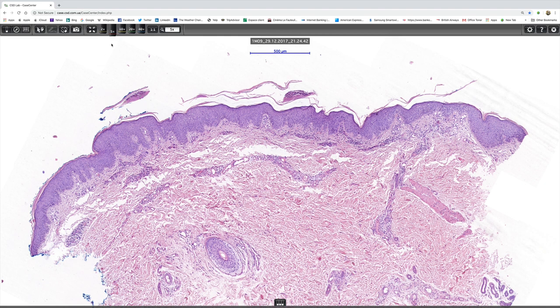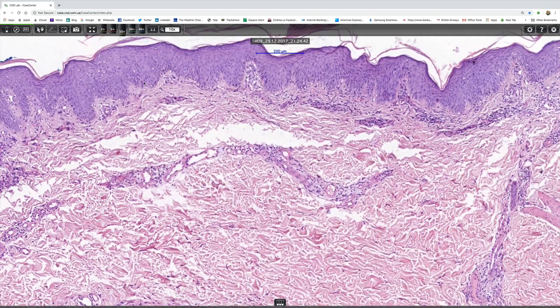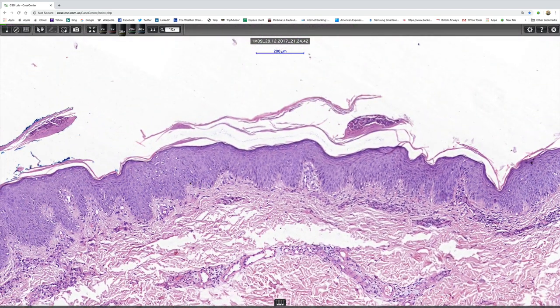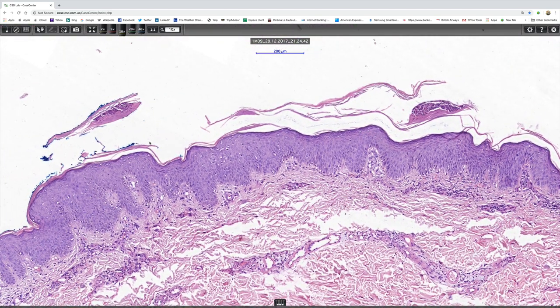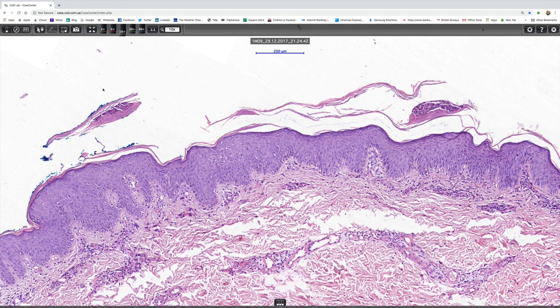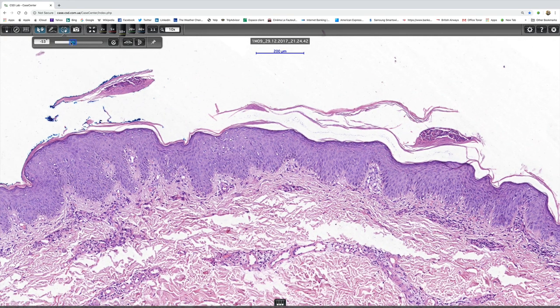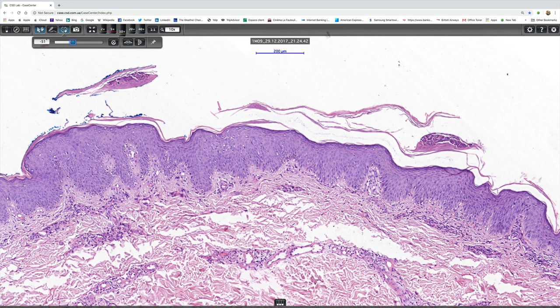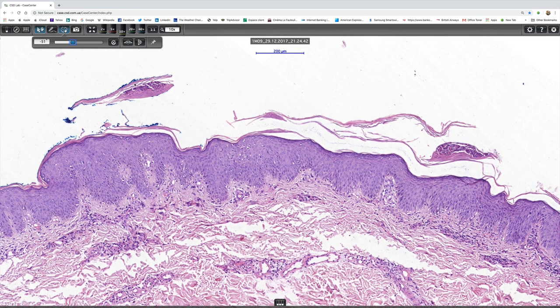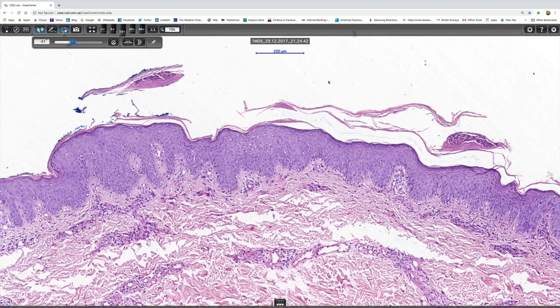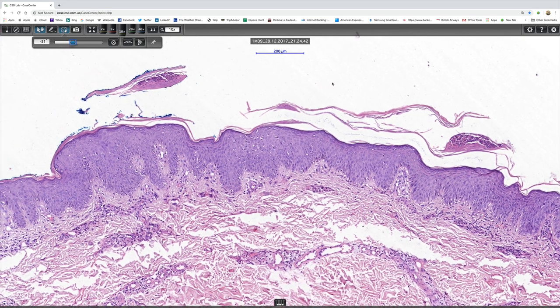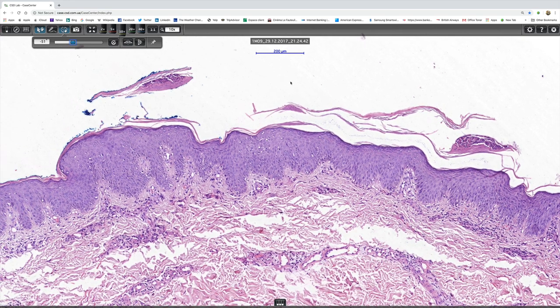Now, let's look at this at higher power and see what. Well, isn't that just so nice? You can see why I couldn't resist showing this to you. It's just a lovely example. There's orthokeratosis. Underneath is parakeratosis and in between there are lots of neutrophils. And the same thing applies on this side. And in the middle, there's a little focus of parakeratosis.